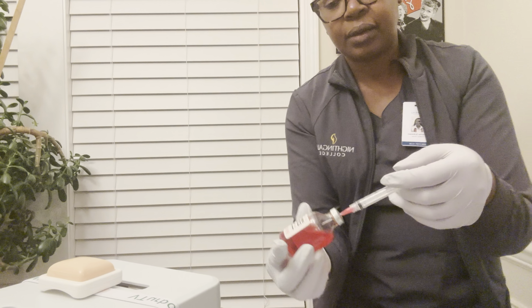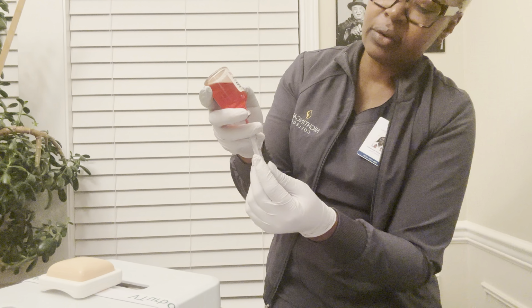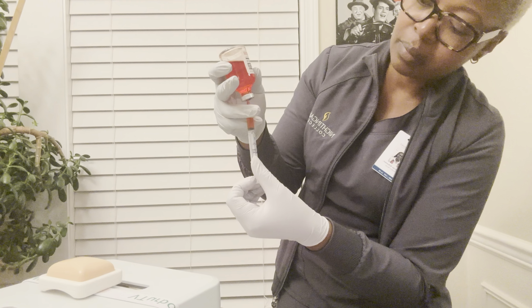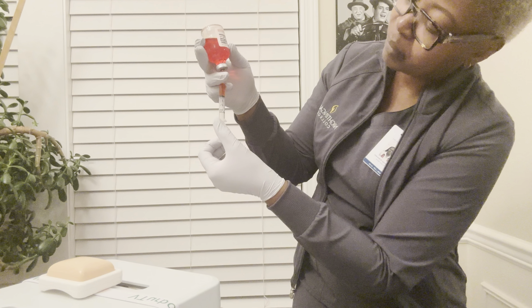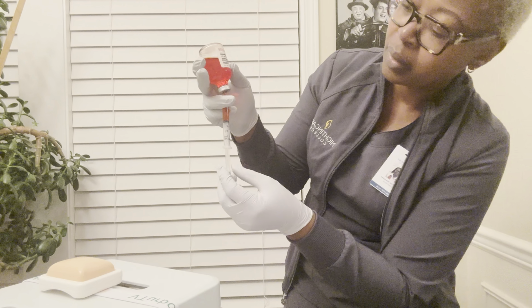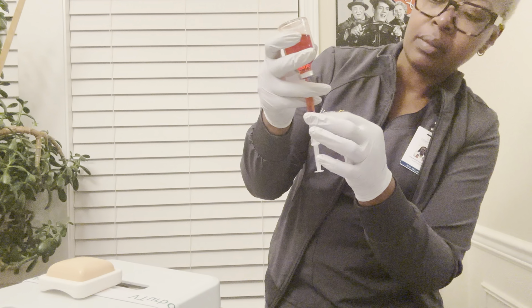I'll invert the vial, and I will draw 1.5 ml, making sure that I don't have any bubbles in there.